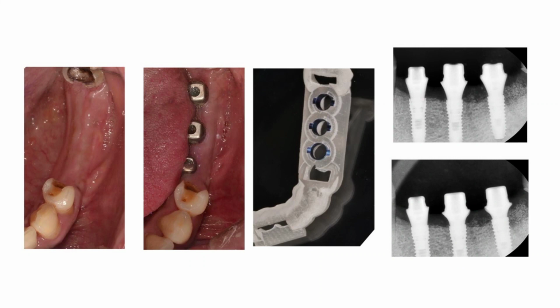You can see here on the upper number 34 site that the digital abutment is not fully seated. And in a situation like this, we can use the abutment profile drill to take off some bone, and then the abutment can be fully seated in place. The abutment profile drills are designed so that the digital abutment can be perfectly seated.